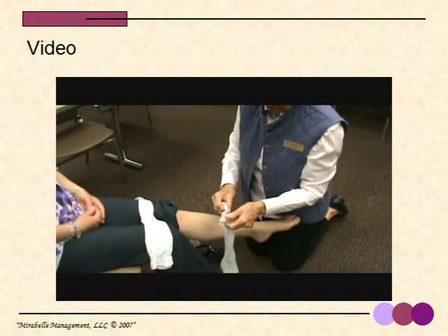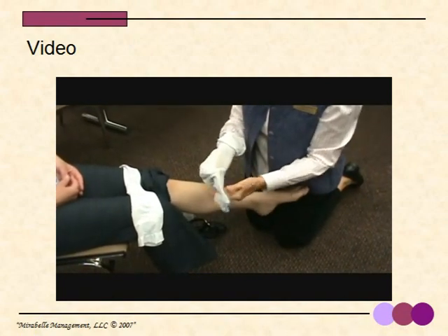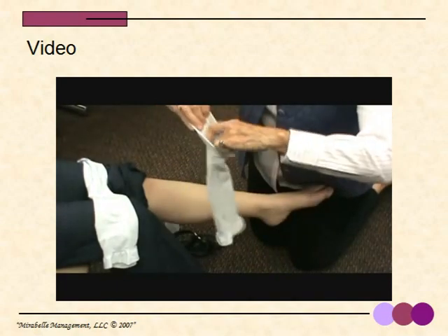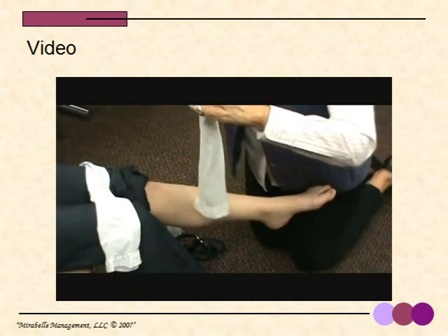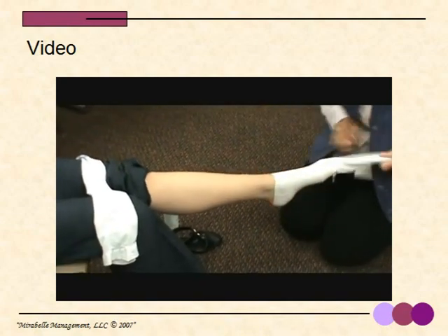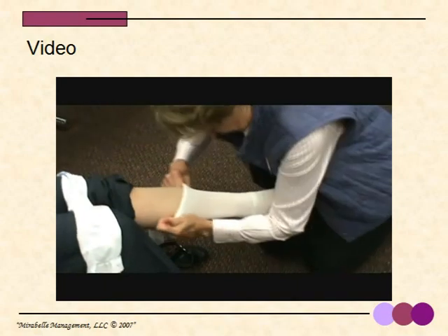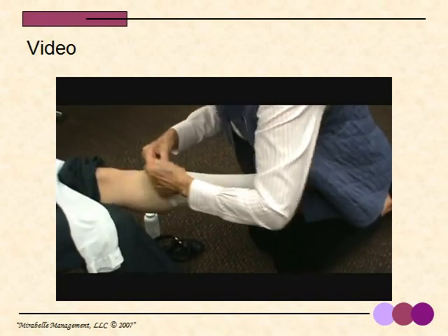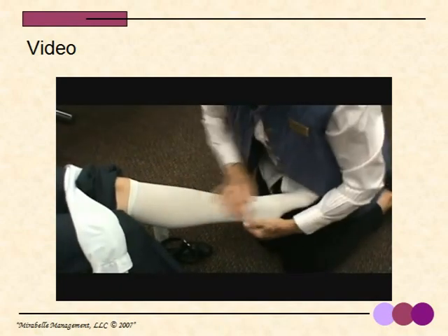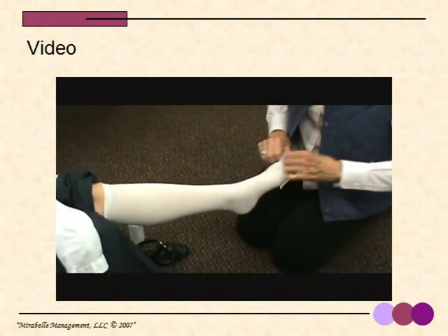I'm just going to slide my hand into the stocking, right down to this heel area here, and I'm going to pinch that heel area together, and then I'm going to put the stocking inside out, holding that heel area. Get that nice and smooth, and now I'm going to fit that heel area onto your heel. Then I'm going to unwrap it here and pull it up about an inch below your kneecap. Get all those wrinkles out. Now, if I want to take a peek at your toes to see if they're nice and pink and healthy, I can just pull that back, and they are.